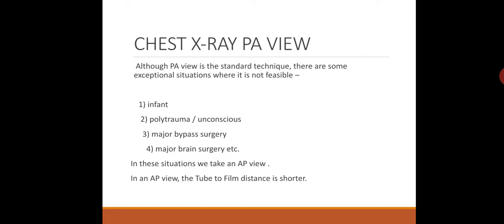That is, first, infant, polytrauma or unconscious patient, major bypass surgery and major brain surgery. In all these conditions, the patient can't stand erect. So, in these situations, we take an AP view, and on comparing with the PA view, the AP view tube to film distance is shorter.